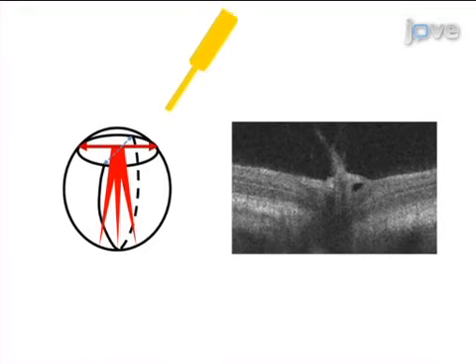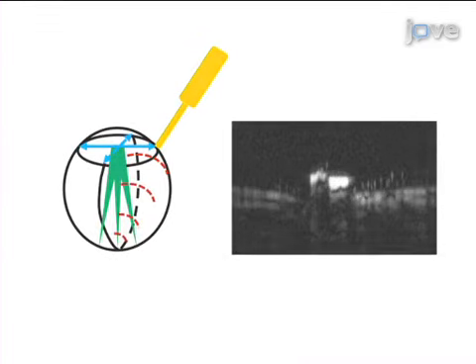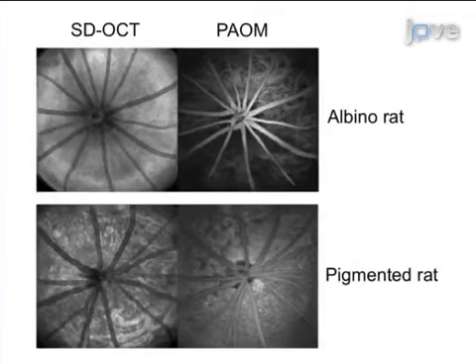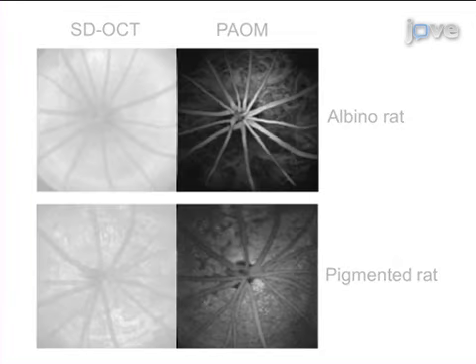A needle ultrasonic transducer placed in contact with the animal's eyelid detects the laser-induced photoacoustic signals and optimizes the position of the ultrasonic transducer for maximal signal amplitude. The final steps are to set the scanning parameters and acquire SD-OCT and PAOM images simultaneously.